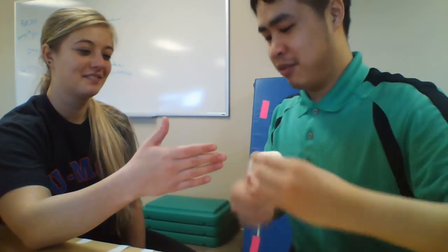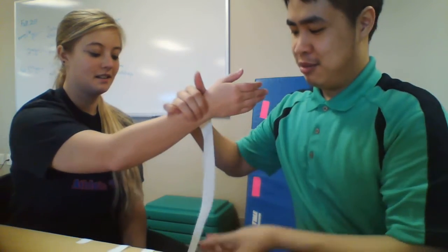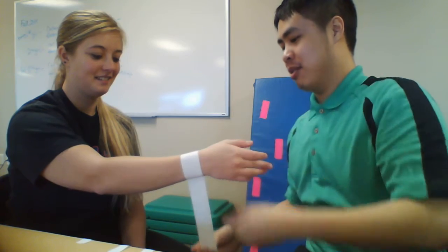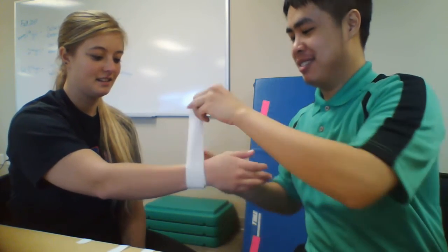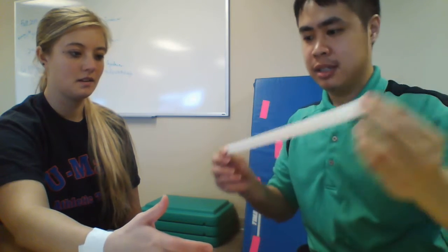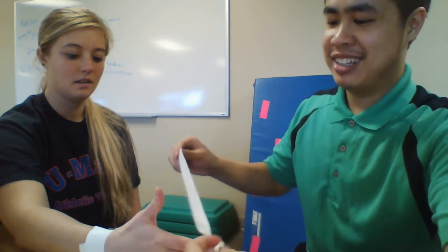So first, let's take the patient's hand. I have the tapes already pre-made. I'll be providing the anchor strips — these are half tape strips.